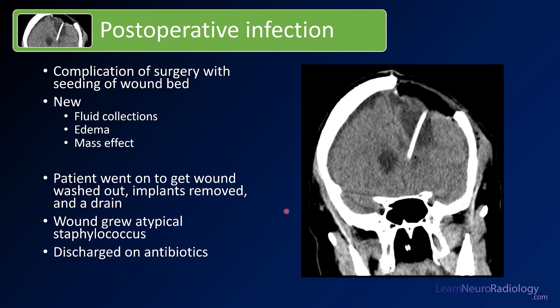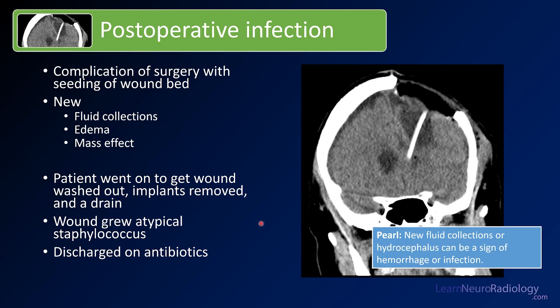These are the things you need to report on your CT: the possibility of infection and whether this person has acute hydrocephalus after surgery. You want to describe the development of new post-operative fluid collections and new mild hydrocephalus. In this case, it was a post-operative infection — they evacuated those fluid collections and placed a shunt. When they washed out the wound, they grew staphylococcus. This tells you that infection can be quite subtle. The fluid collections aren't crazy for a post-op patient, and the hydrocephalus was subtle, but the patient was symptomatic. New fluid collections or hydrocephalus can be a sign of hemorrhage or infection — pay attention to them.